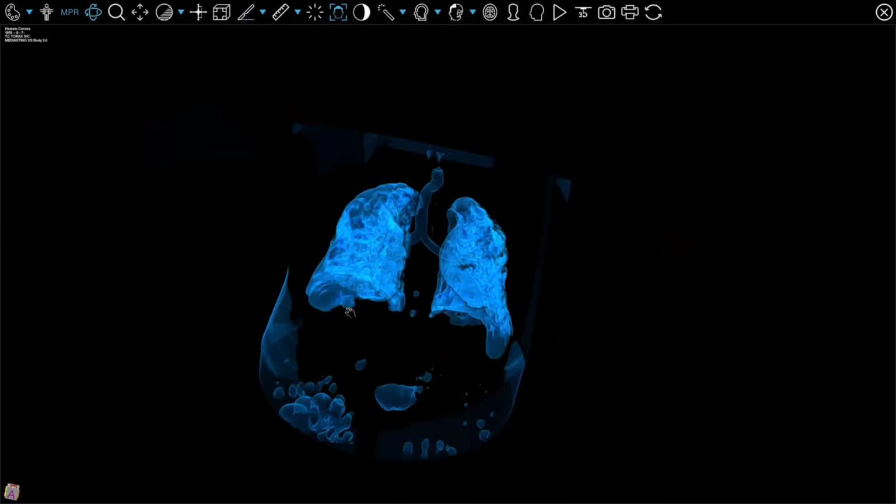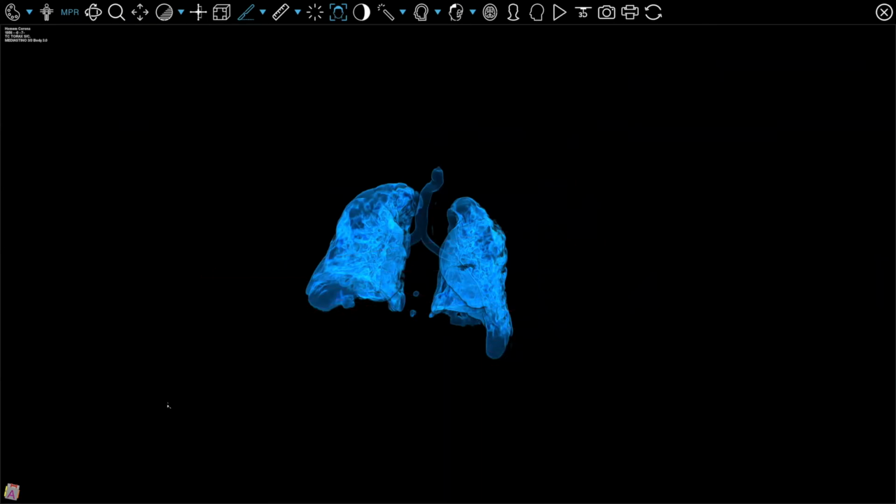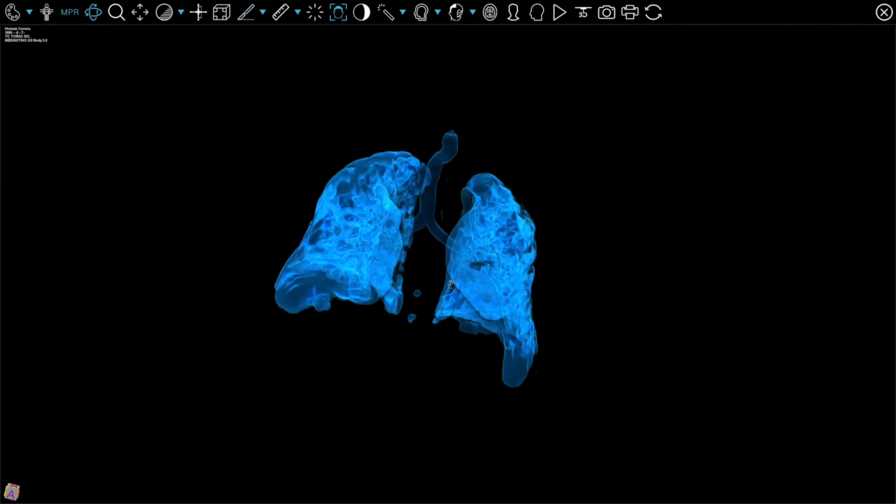Again, this is a real case. This is a real patient where we just had the DICOM information and it was automatically converted into something that we could visualize. So he's removing the additional structure right now so we can isolate the lungs. And for example, the physician here or even the discussion group could do an evaluation about what is being affected in the lungs by COVID.